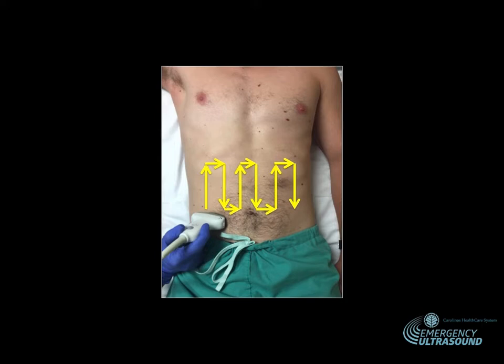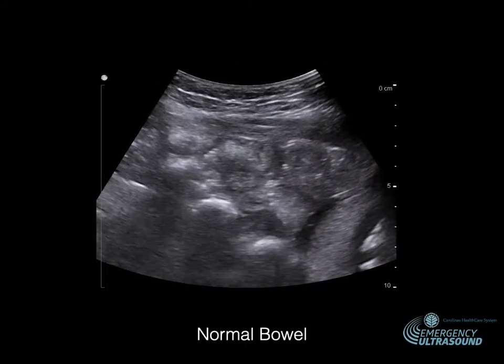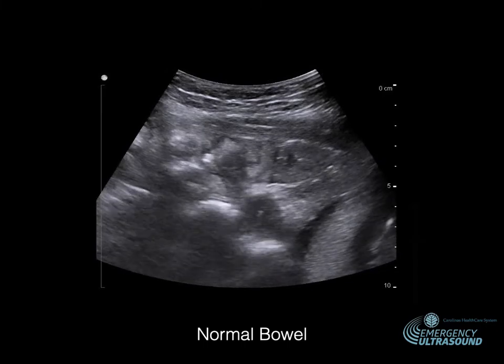When I'm documenting this, I focus on my area of where I'm seeing the pathology, if I'm seeing pathology. Otherwise, I tend to get a picture of the right lower quadrant, right upper quadrant, left upper quadrant, and left lower quadrant. If I'm seeing something, then I'm getting a lot more videos and images around that area. And remember, this lecture is only focusing on small bowel obstruction. Pediatric related bowel ultrasound, appendicitis, intussusception, pyloric stenosis, that's a different lecture for a different time.